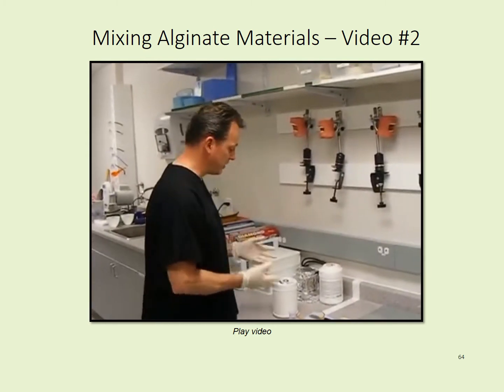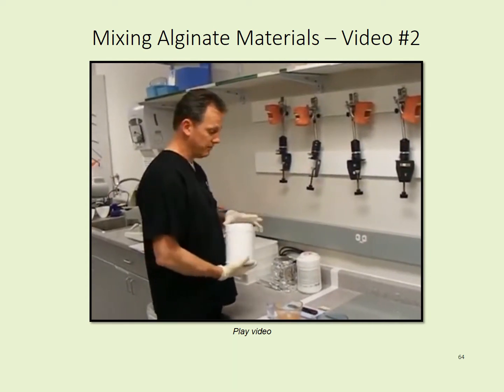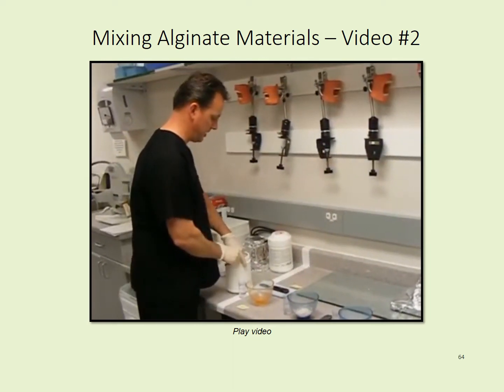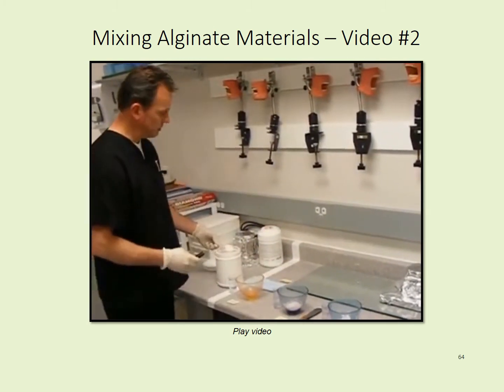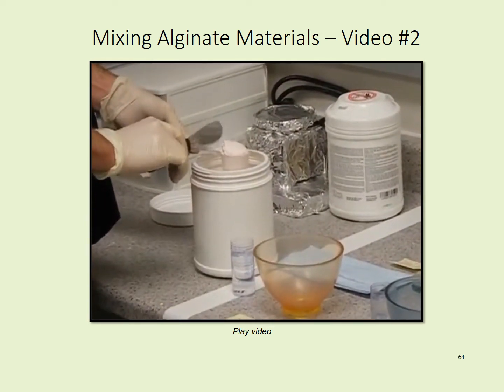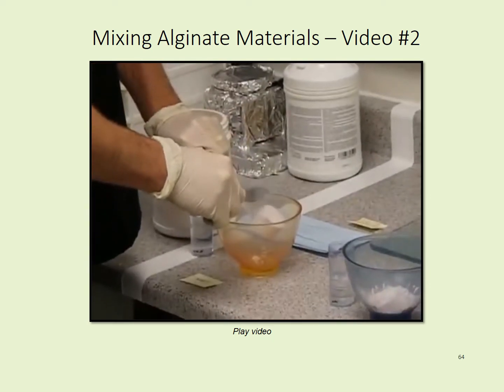Now the first thing that we need to start off with is making sure that we have the proper measuring when it comes to the alginate. So what you want to do is tumble the alginate. We're using a beaver tail spatula to hand spatulate. You can use any spatula, but you don't want an uneven or unmeasured scoop. You want to make sure that you tap a little bit on the handle. You can even tap a little bit through the alginate itself, and then level it off and place it in your bowl.